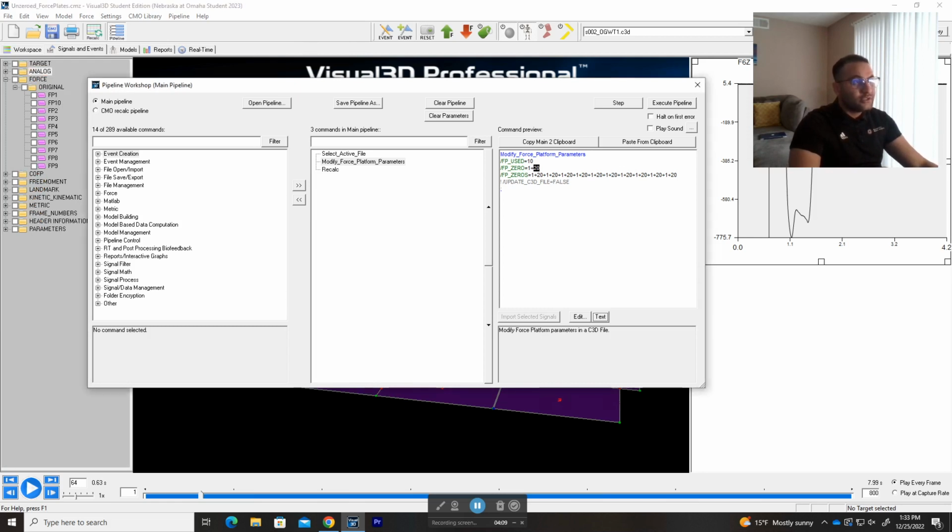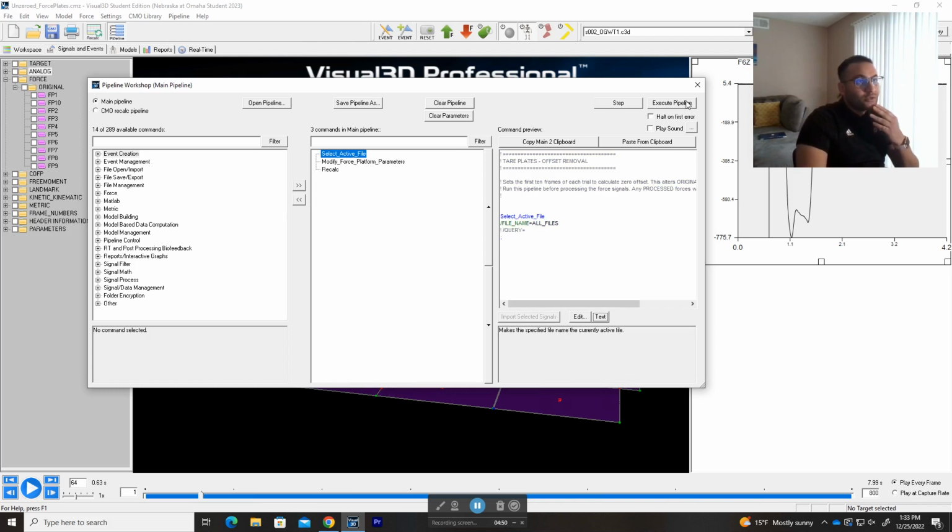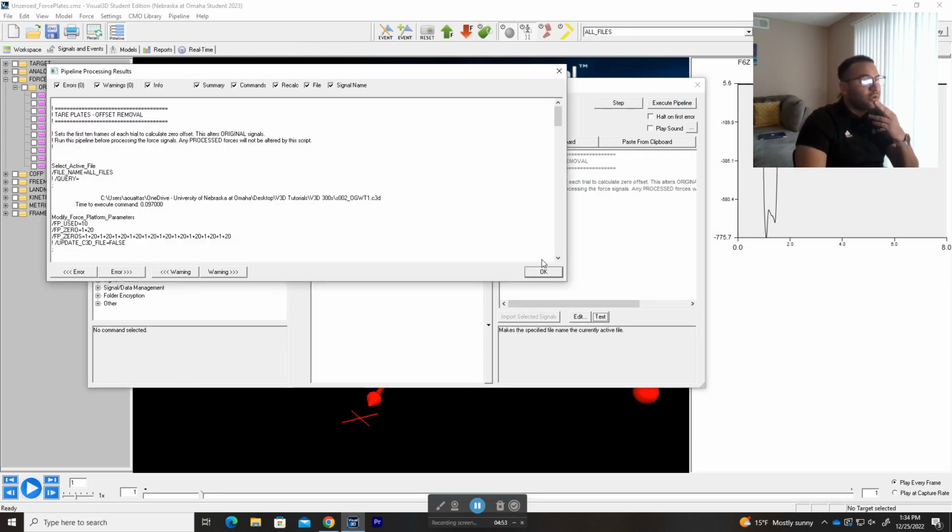FP_ZERO needs to know what specific frames it will use, like the amount of frames and when it starts. So here we write 1, so it starts from frame number 1 plus 20, so it's gonna use the 20 frames starting from frame number 1. And then FP_ZEROS is which force plates I will zero. So here we added that 1 plus 20, and then we added that 10 times to account for the 10 force plates. And then we add the recalculate, so it's just gonna recalculate the whole data. When you execute it, it gives you no errors and no warnings.